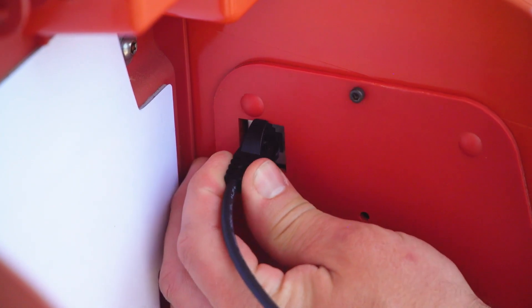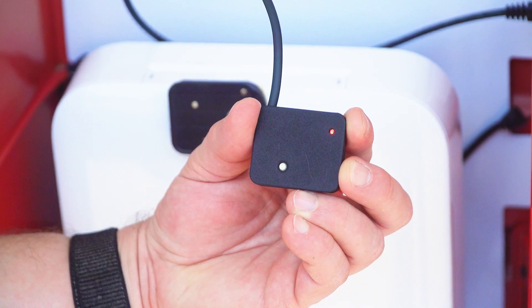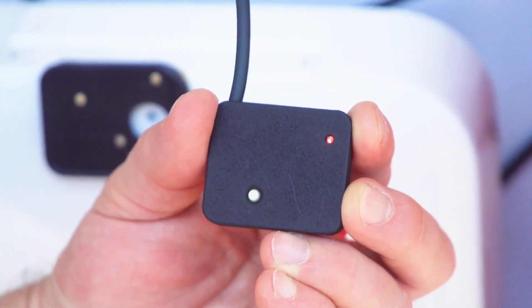The light on the sensor will turn red. If the sensor requires a firmware update, the light will quickly flash red for several seconds.